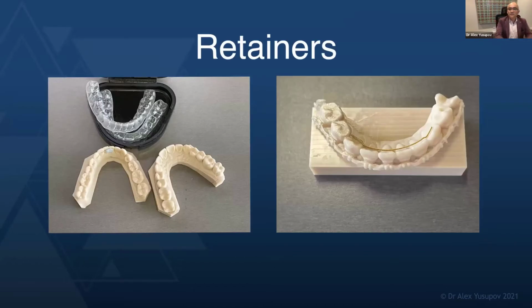So of course, retainers. We use a lot of thermoplastic retainers. Essex retainers are my go-to, and we also do bonded retainers. Now, it's all very easy to do that on the model that doesn't have brackets or wires, but being able to scan a model with braces, a couple of weeks before the D-band appointment allows us to print that model.